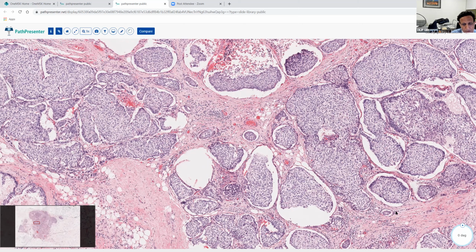But the number of cells is unlikely to grow unless there is some kind of crosstalk between the neoplastic cells that is promoting the myoepithelial cells. That may happen actually, but there is also a chance that the number of myoepithelial cells remains static.